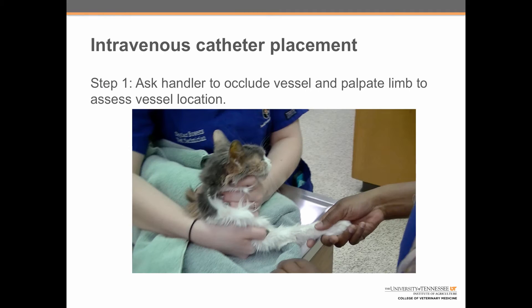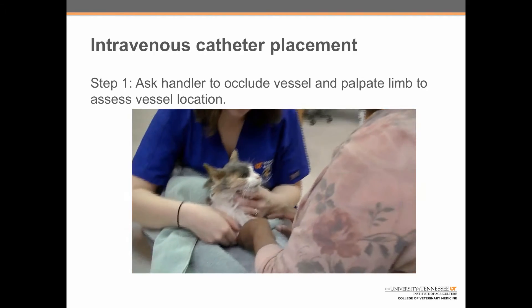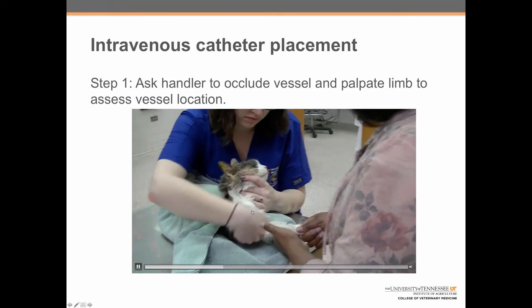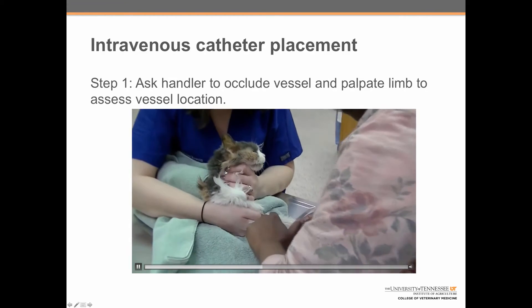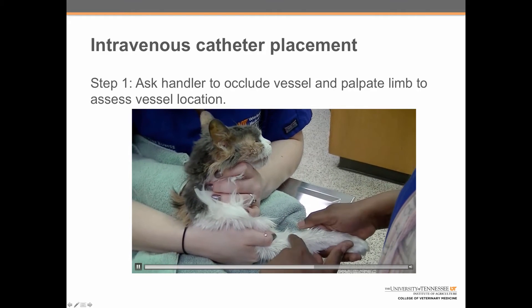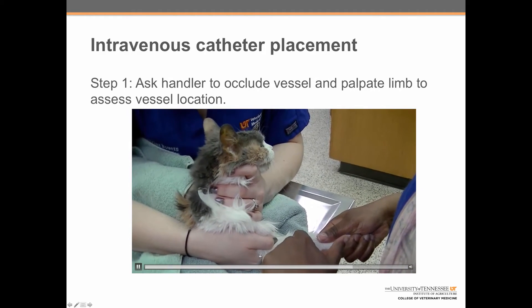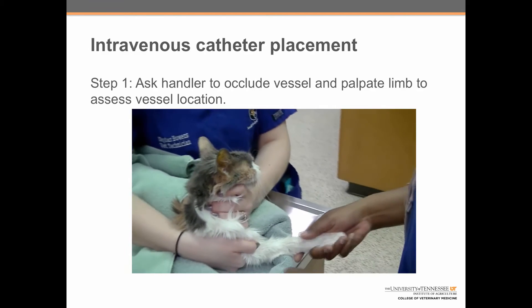Let's go through these steps individually. Step 1: ask the handler to occlude the vessel and palpate the limb to assess vessel location. Here we can see that just like with the dog, the cat is restrained by using a hand to hold the head, and then the other hand is being used to roll the vein upward on the limb with the thumb across the inside of the elbow to cause the vessel to stand out.